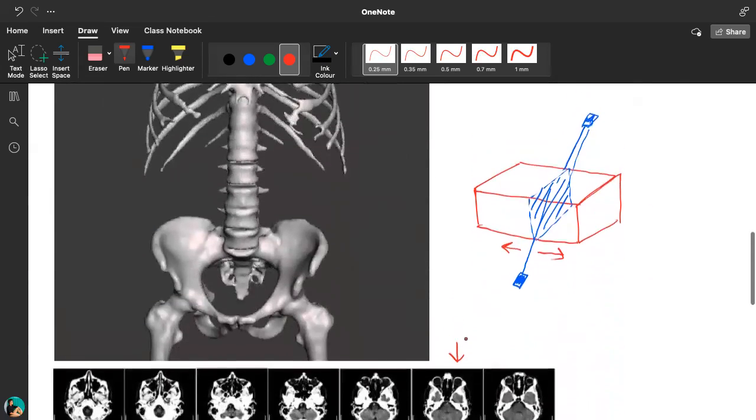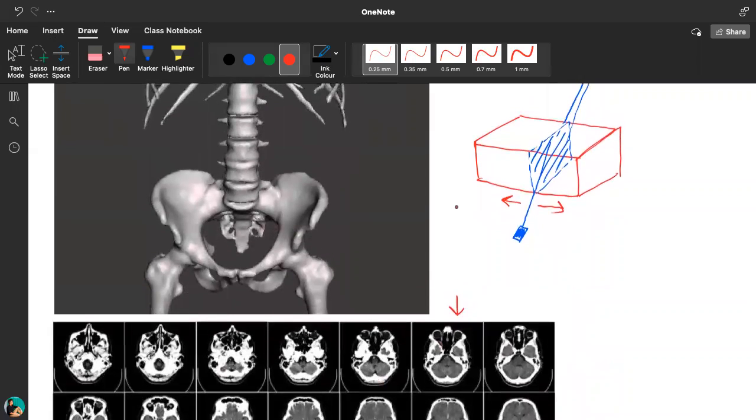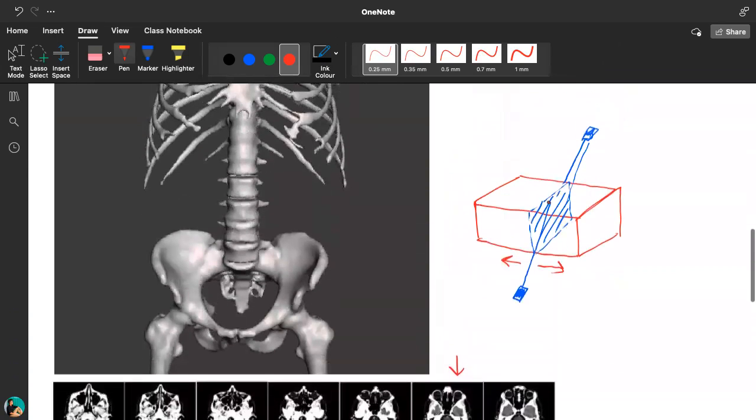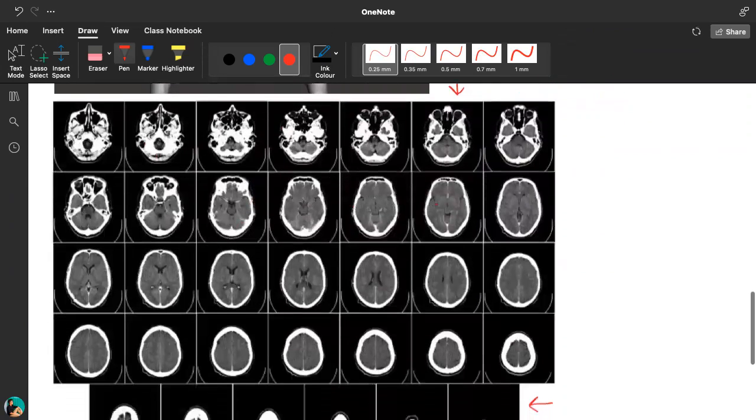So the good thing about this is you can adjust which part you want to look at. I want to look at over here, or I want to look at over here. I want to focus on this slice or this slice. This allows the doctor to find where the cancer cell is. That's why you see these images all look kind of similar. It's because they are taking very, very thin slices of images.